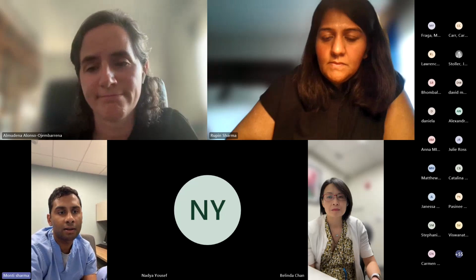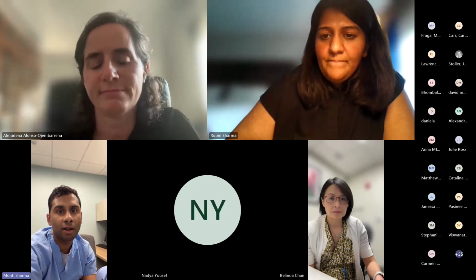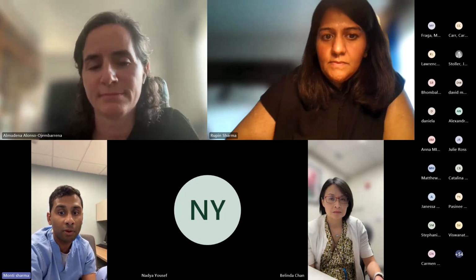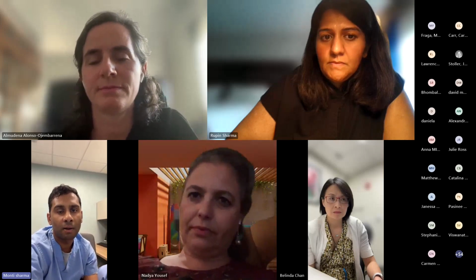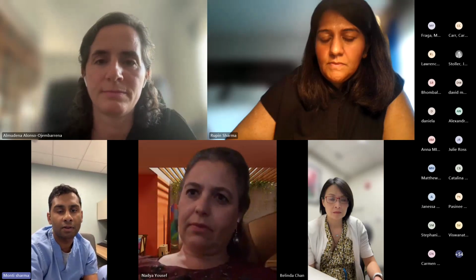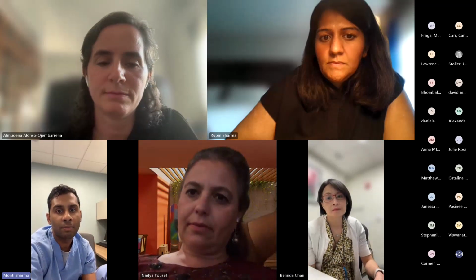So I do think that that's one of the big things that I'd be curious to get your thoughts on, Almudena. I know we've been working on trying to get everyone into the BPD collaborative, but I'm really hoping for those people that are in there that we can do some of these prospective studies with centers that do have credentialed providers looking at some of these questions. Like, how can we use this and leverage this tool and separate this out?